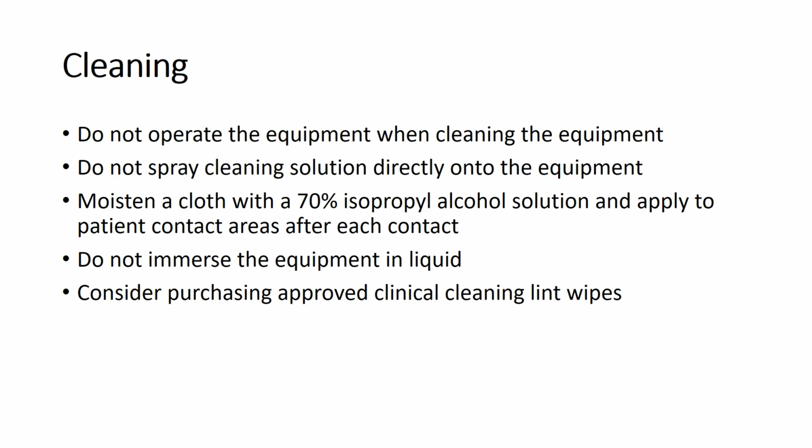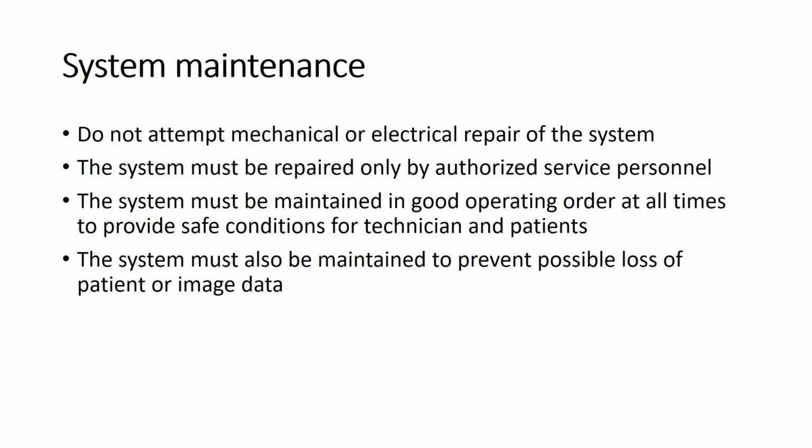Do not immerse the equipment in a liquid. It destroys the plate, so you should be very careful. Consider purchasing approved clinical cleaning lint-free wipes. So, these are certain points for cleaning of the DR plates.